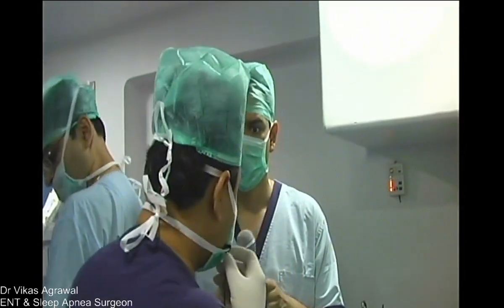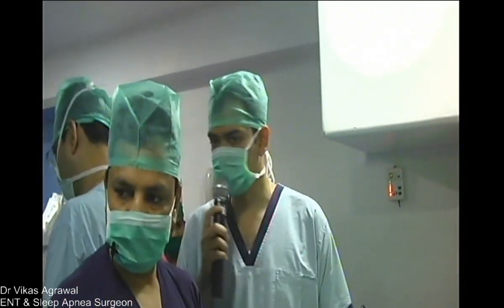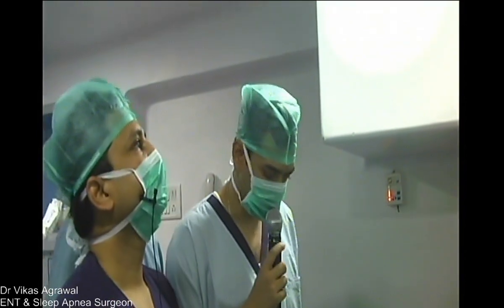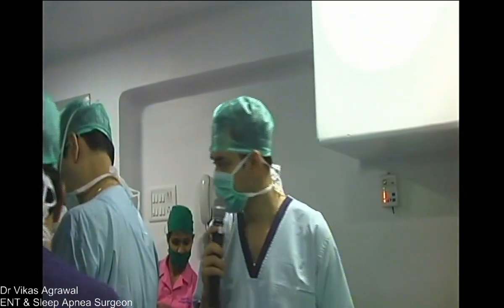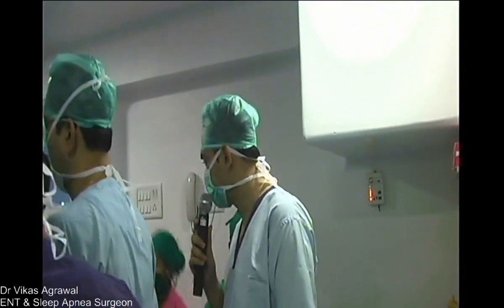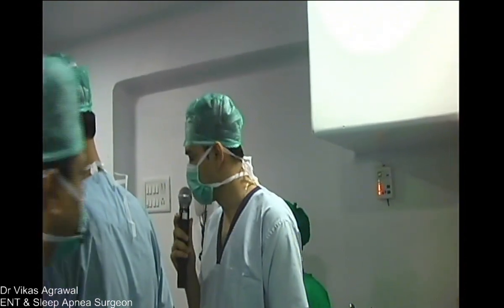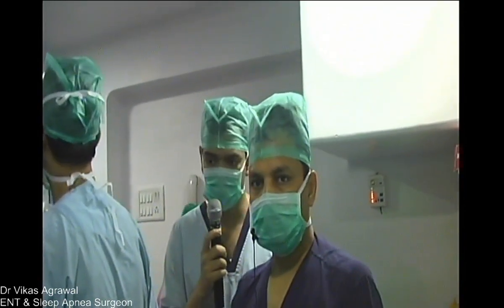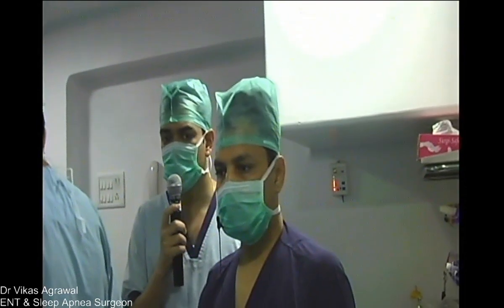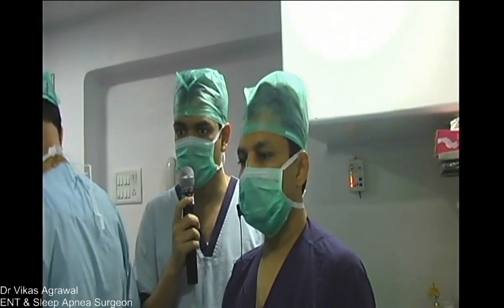Yeah, okay. So, bispectral index monitoring, you want to talk? Yeah, so one of the challenges when we do a drug-induced sleep endoscopy is to ensure a good plane of sedation. There are a couple of methods you can do that. One is the BIS monitoring or the bispectral index monitoring, which tells us in terms of the plane of anesthesia and which can guide us to whether we have adequately sedated the patient. Because if you have a patient who is a little light, you're not going to document all the obstructions. Whereas if you have a patient who's too deep, you'll see obstruction at every level.